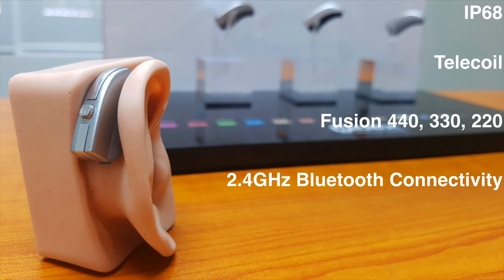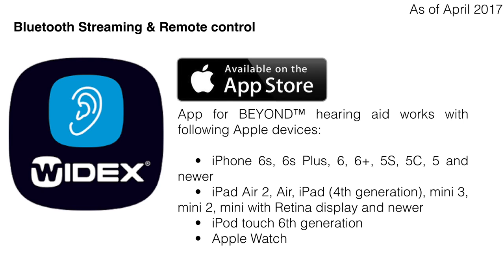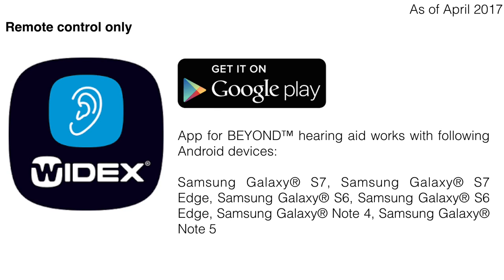Since it is a made-for-iPhone hearing aid, it connects via Bluetooth and can also connect to Android phones, though with limited features. The Fusion will fit most hearing losses as the receivers are interchangeable, allowing a more powerful receiver to be fitted. The Widex app is in the Apple App Store and compatible with recent iPhones, enabling Bluetooth streaming of phone calls and media, volume and program control, and fine-tuning. The app is also on the Google Play Store, but for Android it can only be used as a remote control, as Android does not currently allow Bluetooth audio streaming to hearing aids.